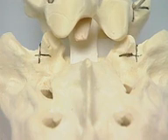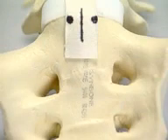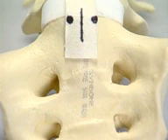The surface markings are drawn on the model using a marker, and the ideal exit points for the bicortical screws are shown on this model. Laterally exiting screws may injure the L5 nerve root, but the overhanging pelvis may limit the possibility of screws converging near the midline.